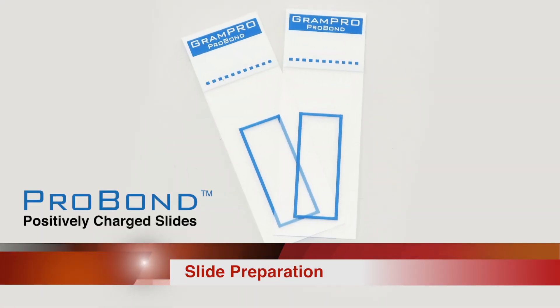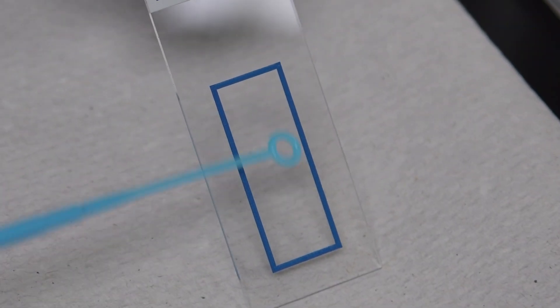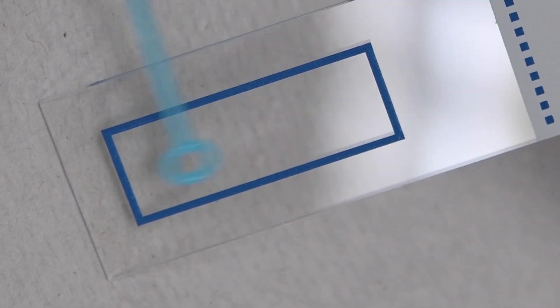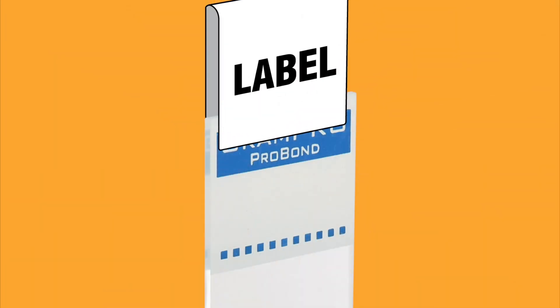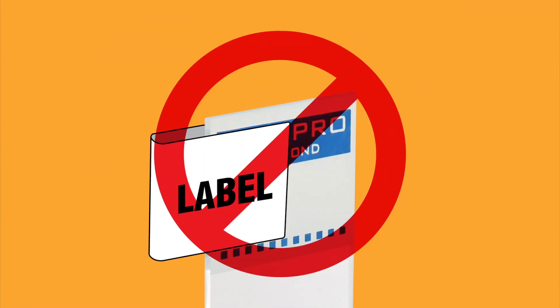Only ProBond frosted glass slides can be used with the GramPro1. Place the specimen in the blue box in the center of the slide. It is important to keep the specimen within this region in order to leave at least ¼ inch along the sides of the slide blank. Labels can be wrapped over the top of the frosted region only, never around the edges of the slide.